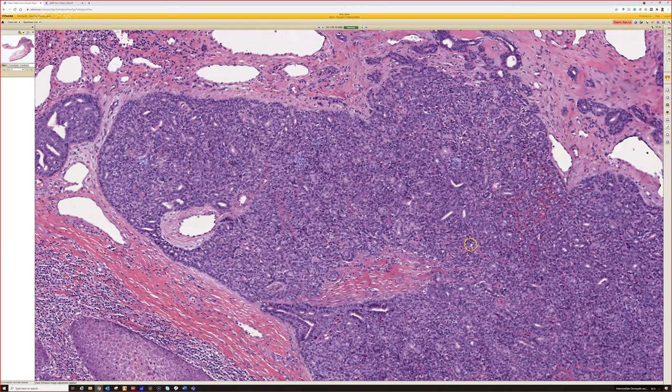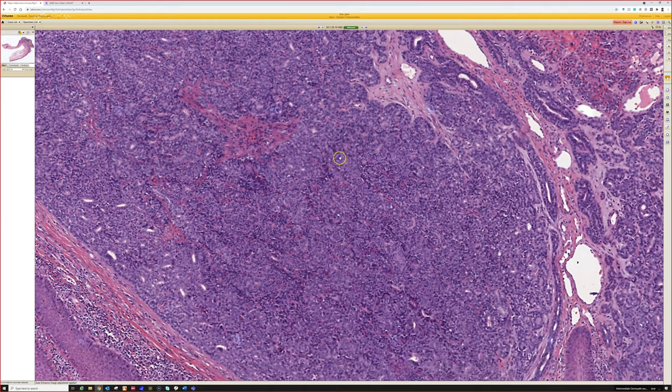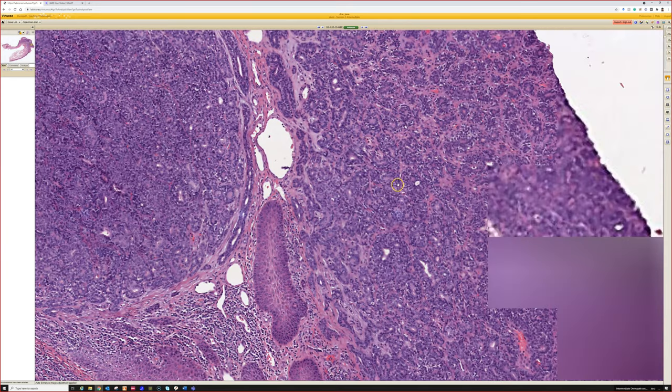Anytime I see any sweat gland tumor in the palms or soles, particularly on the fingers or toes, I always think about, could it be papillary digital adenocarcinoma? Because these tumors are sometimes very challenging to diagnose. They can be very bland. They often do not have much cytologic atypia. They can, but I've seen multiple examples that were very, very bland.